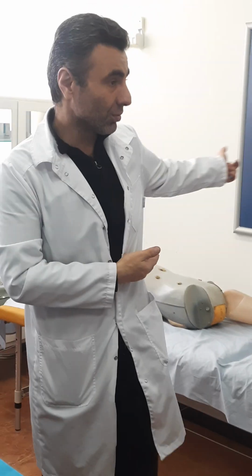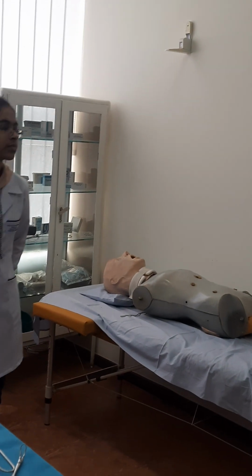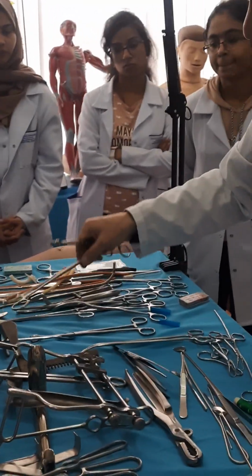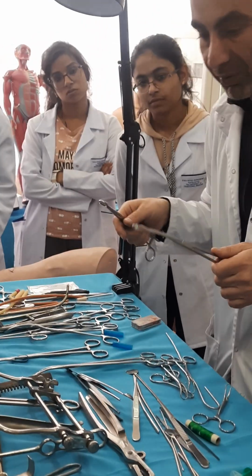Again, friends, now I don't teach you how to make the surgery. I teach you how to use the instruments only. So it's not necessary now to study how we make these sutures and anastomosis and anything else. I just show you how we use the surgical instruments and which surgical instruments we use for such kind of manipulation. A huge amount of perforated, otherwise we call fenestrated, type of forceps.